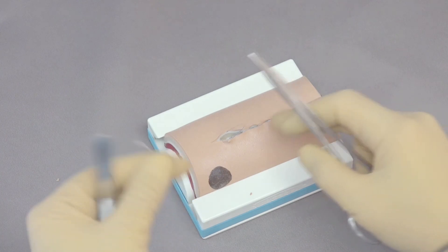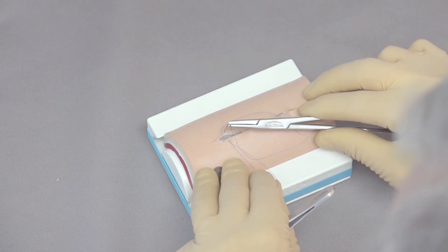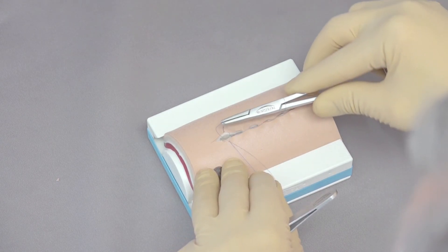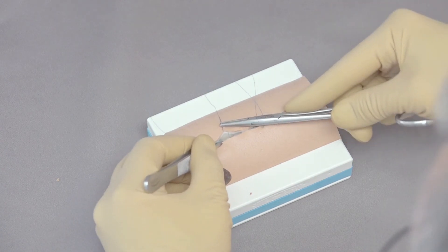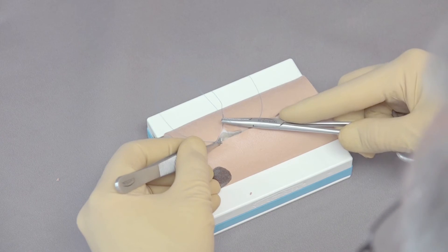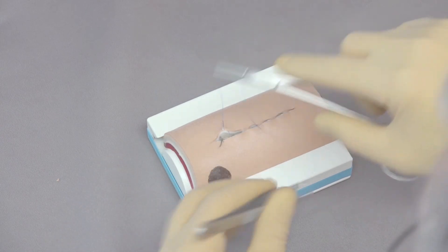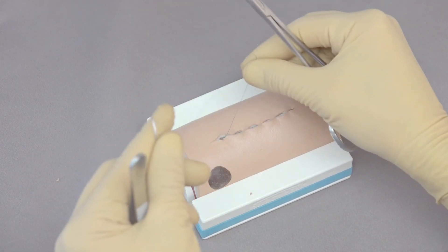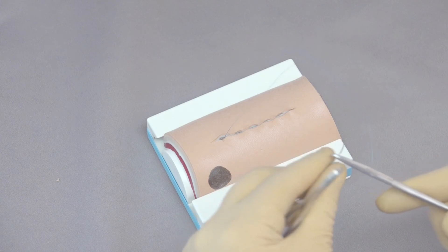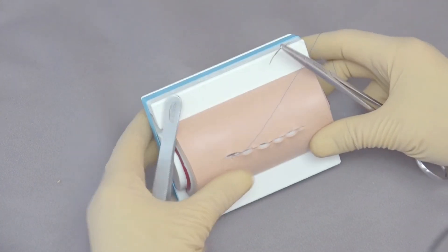And now it's time to go ahead and make our knot. So we want our knot to be at the bottom, so that means we have to start by getting a deep bite. So we're going to come at the dermis and epidermis and now instead of going parallel, which is what we've been doing, we're going to go perpendicular to the bite, to the incision. We're going to bring that through and tighten that up. So we're going to tighten that down. So this one comes from the bottom. That's good. That's the beginning of our knot.